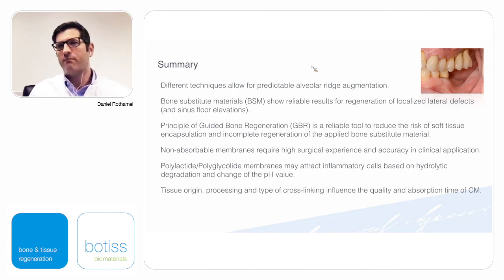For collagen membranes, we see better results and lower complications when we compare them to the absorbable alternative polylactide and polyglycolide membranes. However, collagen membranes differ significantly in terms of quality and absorption time.